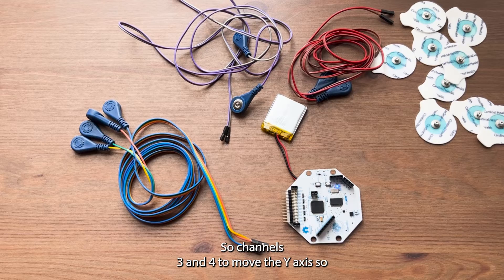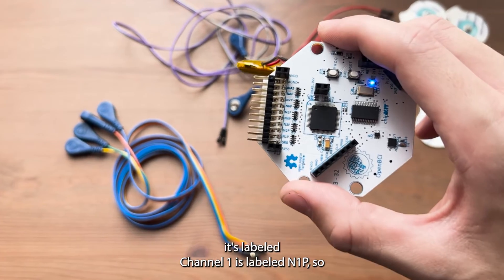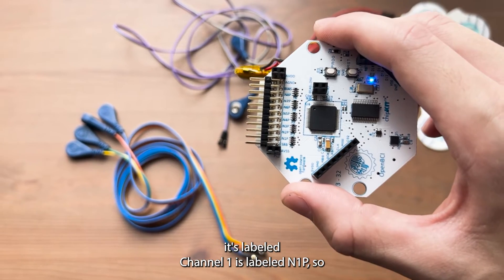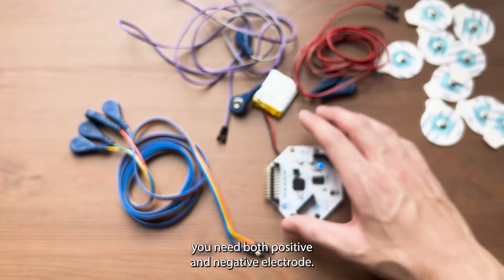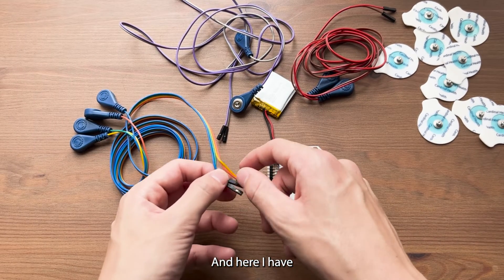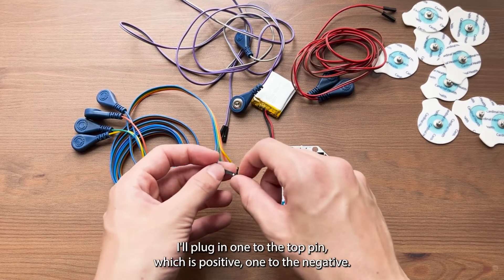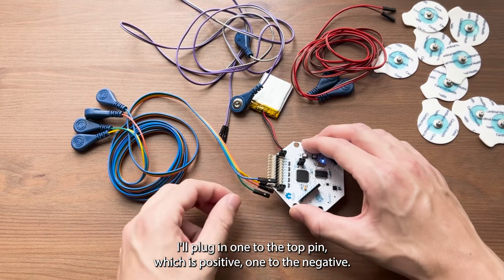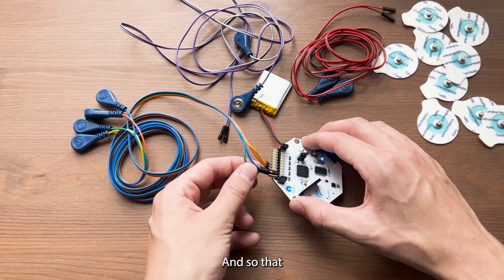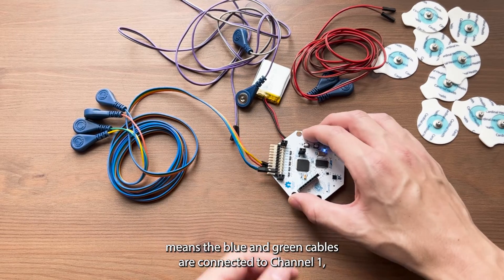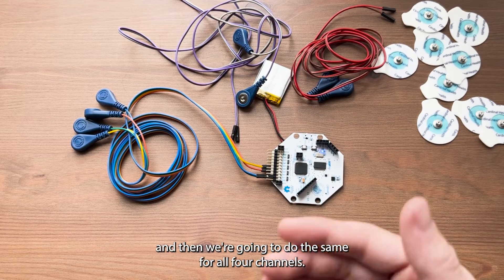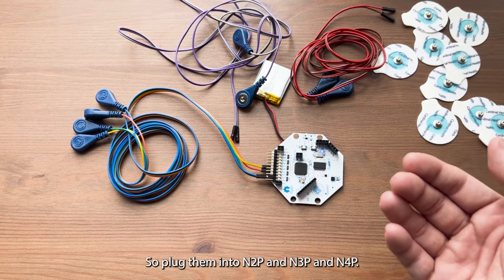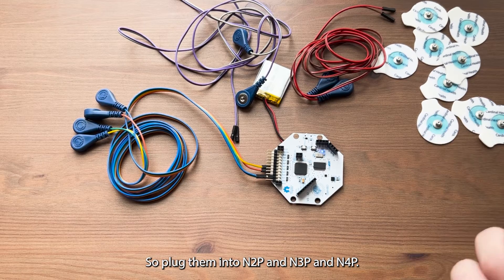On the Cyton here, it's labeled channel one N1P. You need both positive and negative electrode. Here I have these cables. I'll plug in one to the top pin, which is positive, one to the negative. So that means the blue and green cables are connected to channel one. And then we're going to do the same for all four channels. So plug them into N2P, N3P, and N4P.